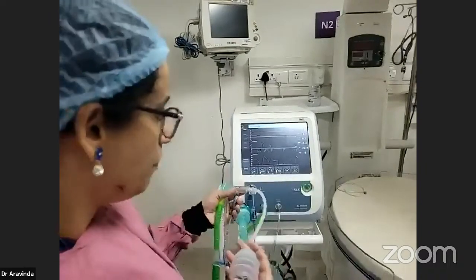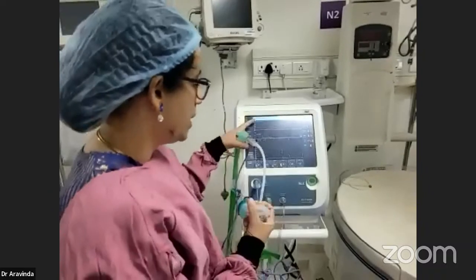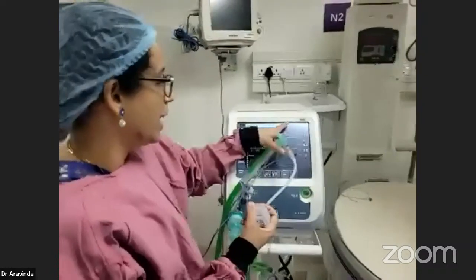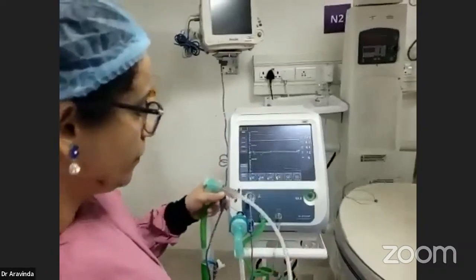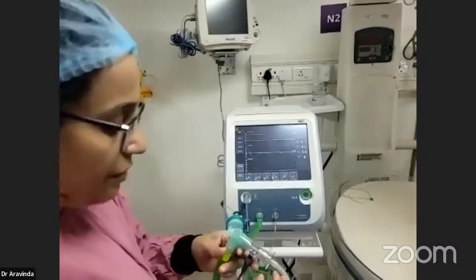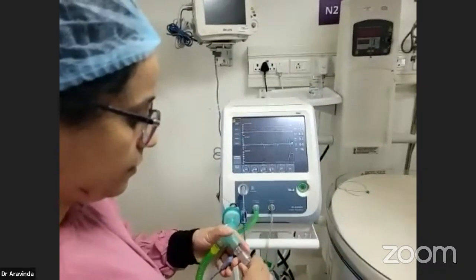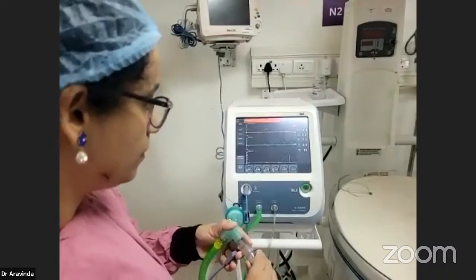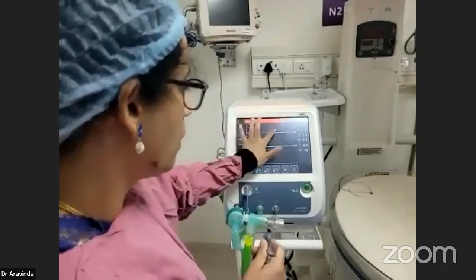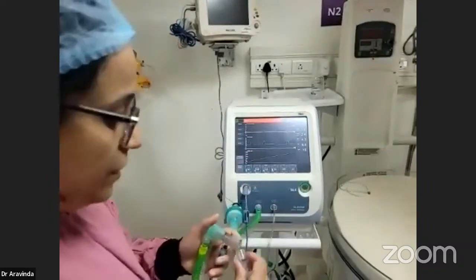And if we keep a high pressure, it will show here as a high pressure in the pressure scalar, and it's showing the high tidal volume also now. What will happen if there is any leak in the circuit? The PIP will obviously go down, it will not be as much, and after some time it will show a high leak also here.